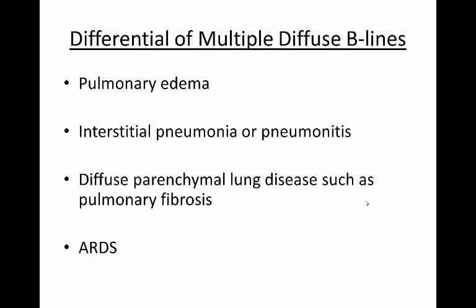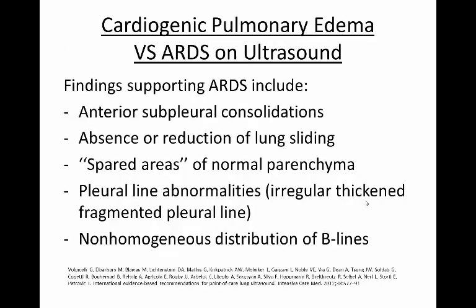If a patient presents with multiple diffuse beelines evident on ultrasound, there could be many different differential diagnoses, including pulmonary edema from various causes, interstitial pneumonia or pneumonitis, and diffuse parenchymal lung disease such as pulmonary fibrosis or ARDS. Ultrasound findings that support the diagnosis of ARDS include anterior subpleural consolidations, absence or reduction of lung sliding, spared areas of normal parenchyma, pleural line abnormalities like irregular thickened fragmented pleural lines, and non-homogeneous distribution of beelines.